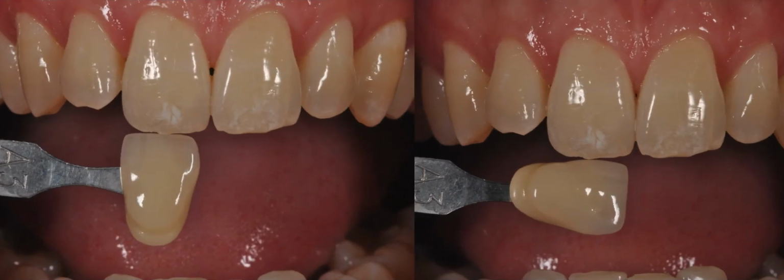Finally, the upside down position, used by many dentists and one that creates mistakes as well. Since we are using the area of the tab that is translucent, it normally makes us select a darker tab and a false positive. One more time, let's compare this position with the horizontal position. And you can see that using the same tab and amount of ambient light, only the photo on the right actually matches 100%.